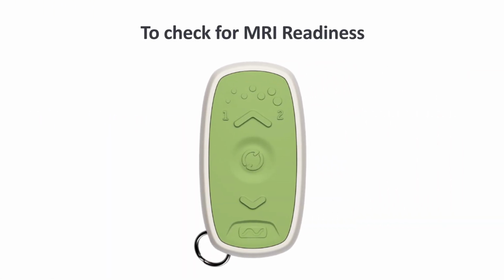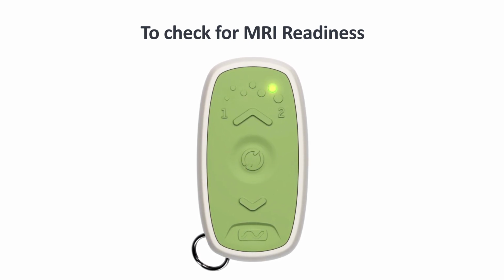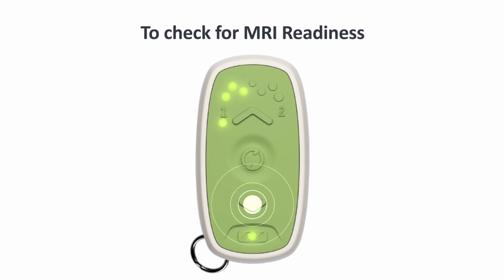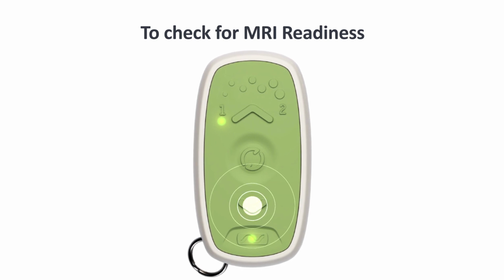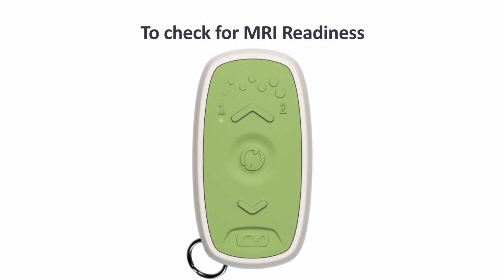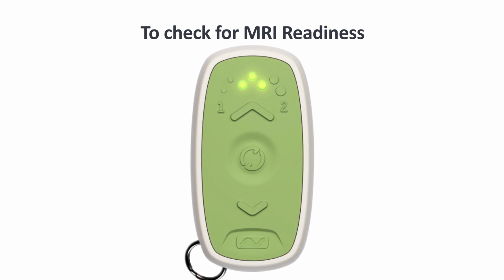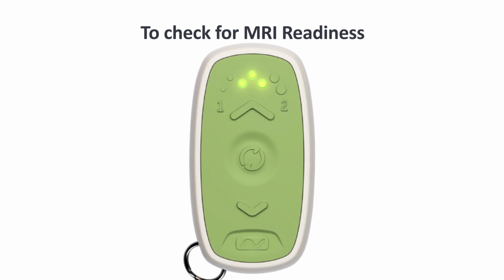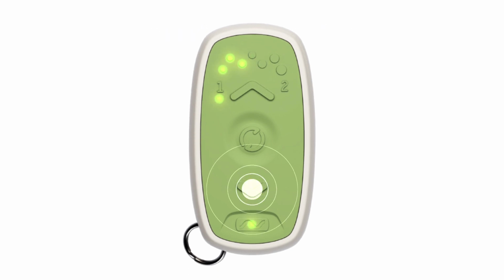To check for MRI readiness, just connect your remote control to your implant. Hold the down arrow for 5 or more seconds to turn off your stimulation, and then press and hold the down arrow again for 5 more seconds to complete the MRI readiness check. If you're ready for an MRI, the middle 3 lights at the top of the remote control will turn on. Instructions for checking MRI readiness with your remote control are also on your MRI readiness sheet. If an MRI readiness check is not required for your scan, simply turn your stimulation off before the MRI. Now you're ready for your MRI scan.